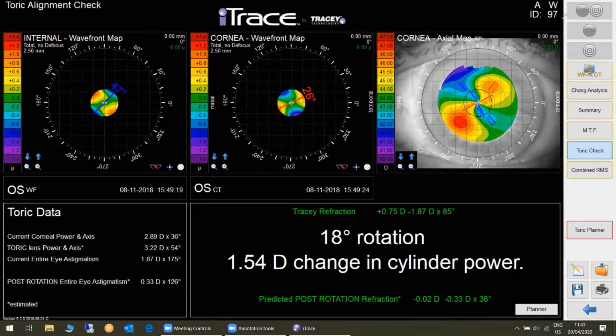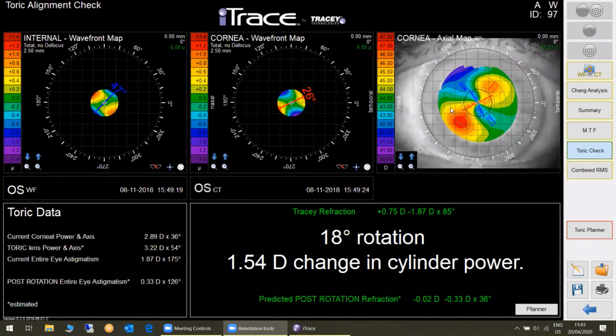So this is really something, because these are the cases. Now you dilate the patient, and the lens is sitting exactly where you've planned it. And you can go to www.astigmatismfix.com whenever you want. And now your fantasy starts to go. Your fantasy, now this might be a retinal astigmatism, or even worse, the back of the cornea. And the only thing that is wrong here is that you measured in a wrong spot.